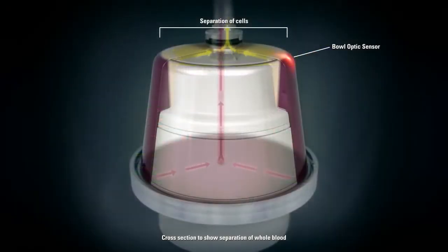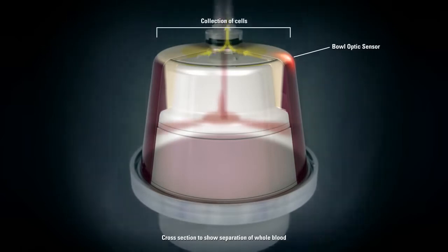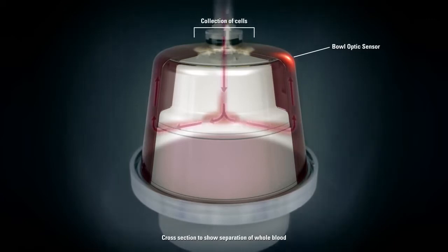When the whole blood process target has been reached, the collection of the harvested cells is triggered. This process begins by collecting a small amount of additional whole blood from the patient which pushes the layer of red blood cells up and displaces the concentrated leukocyte fraction out of the top of the centrifuge with minimal RBC contamination.